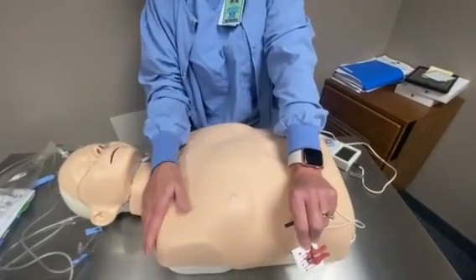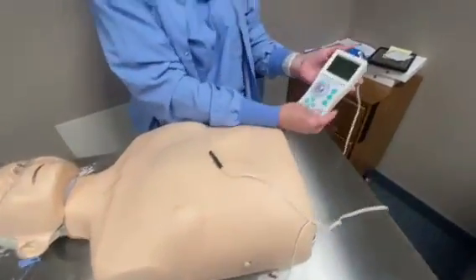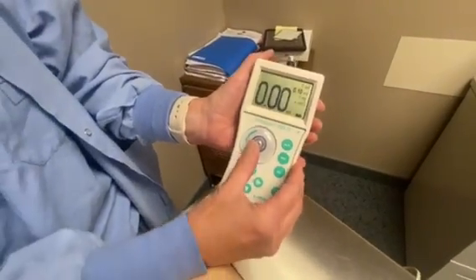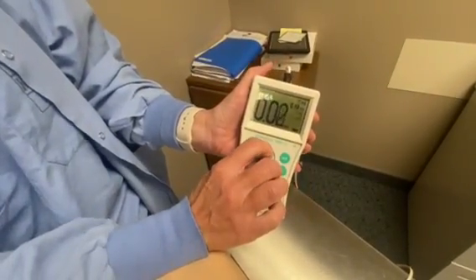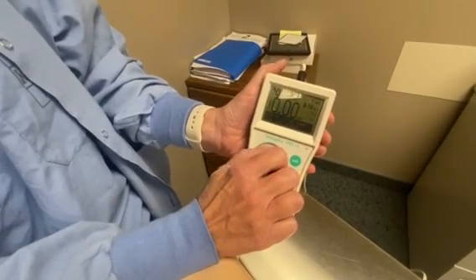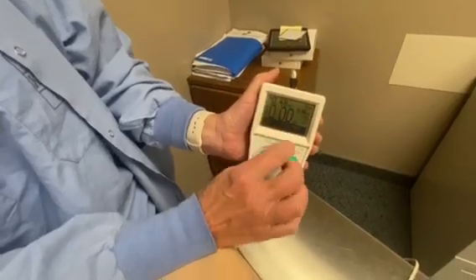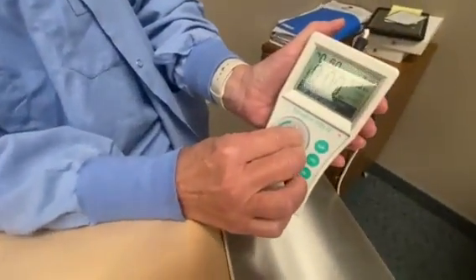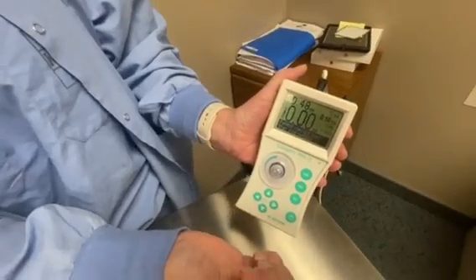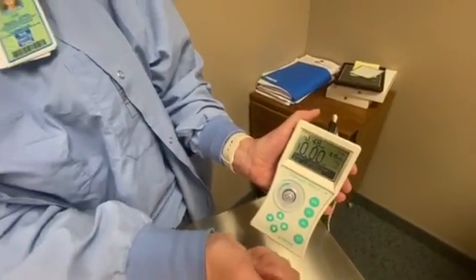You want to be sure that it's away from the site they're going to be working on. Put that on, turn it on by holding this button down here at the bottom — it takes a minute — and then turn it to 0.48. Almost every doctor uses 0.48 for the shoulders. If they're doing a popliteal, they'll often ask for it to be at 0.6. Just gently turn it and watch these numbers — that's where they like it to be. You'll get a twitch when they get close to the nerve bundle; you want to watch for that.